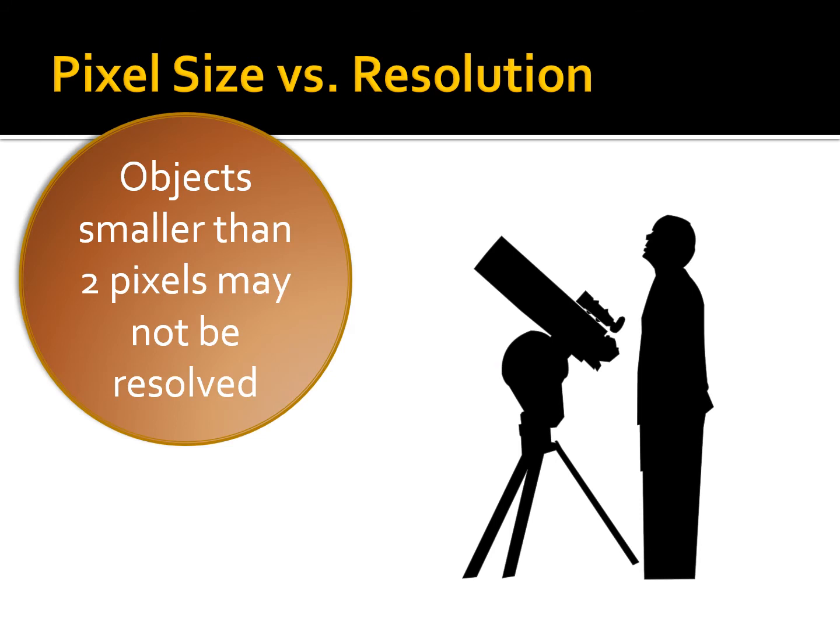In radiology, we measure resolution in units of line pairs per millimeter. For more information regarding resolution measurement, refer to my Foundations of Detail video. For an object or line to be reliably recorded and not ignored by the computer, it needs to span a minimum of 2 pixels.